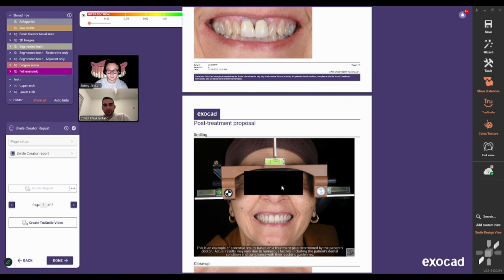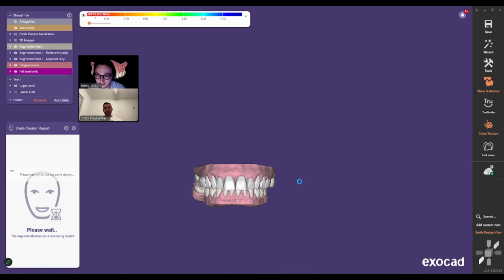I totally agree on that. I see so much value in this, and I love how you see the value in it, and it's already paying off for you. 100%, no doubt. And with that report, now it's just a game changer.